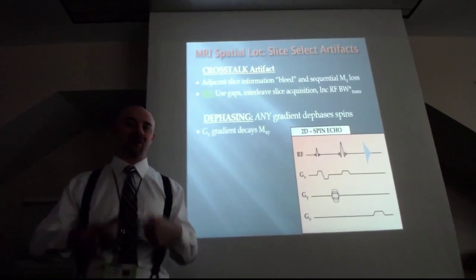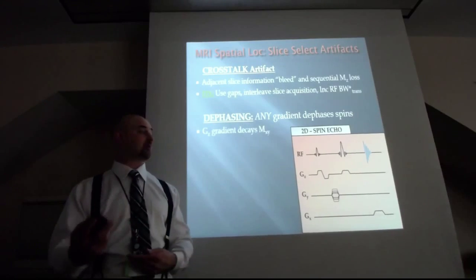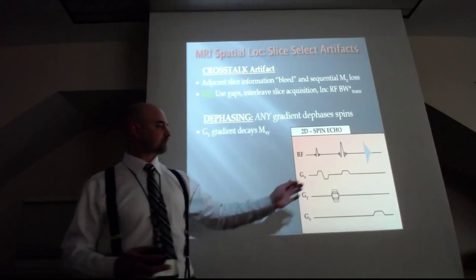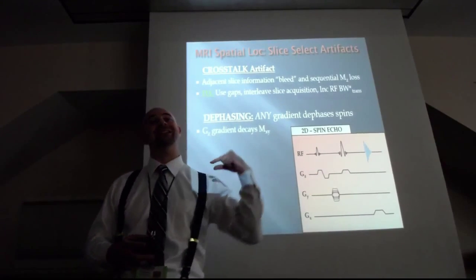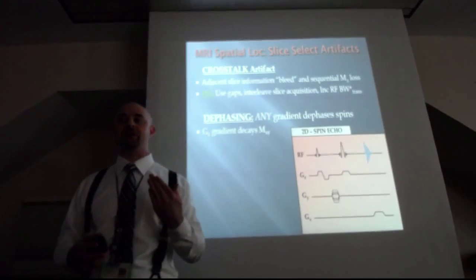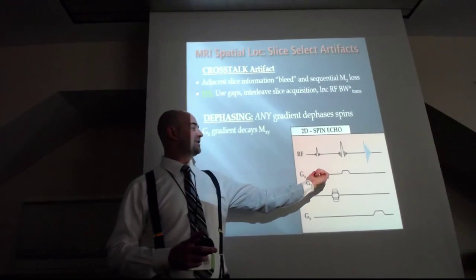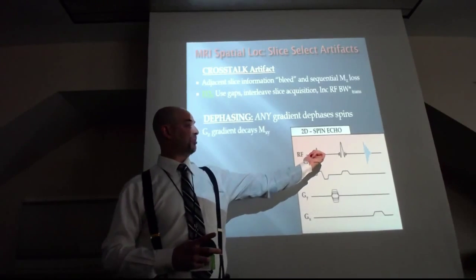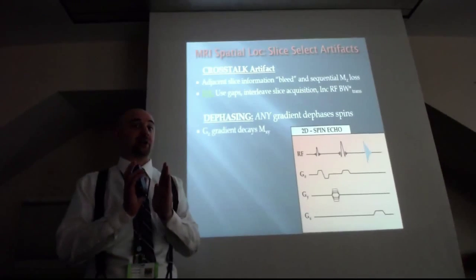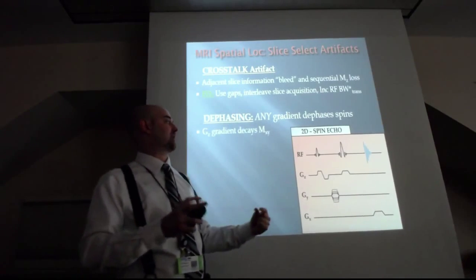So, kind of like when we do the 180 RF pulse and things passively rephase, and you get a reformed echo, you actually do something that's more direct, which is we apply the Z gradient in the opposite direction. So apply a negative gradient, which will unwind the dephasing that has occurred. Does that make sense? So I have to have the Z gradient on while I apply the RF pulse. That's how I'm selectively exciting only one slice. That's what makes it those 5 millimeters of the image you're looking at.